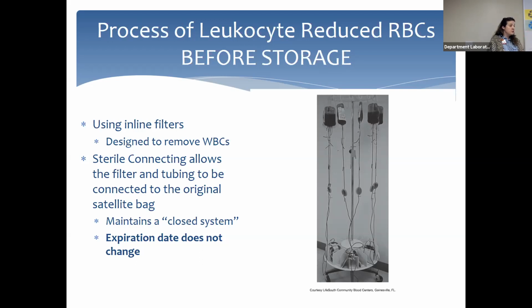During the transfusion process at the patient bedside, it will also be filtered, all right? It's a 170 micron filter that will be used on red cells and platelets. That filter is only to collect any type of debris or trash that might have been in that unit because it has sat in storage for an amount of time. That filter only collects debris, and any kind of fibrin that might be collected in that unit over the storage, all right?